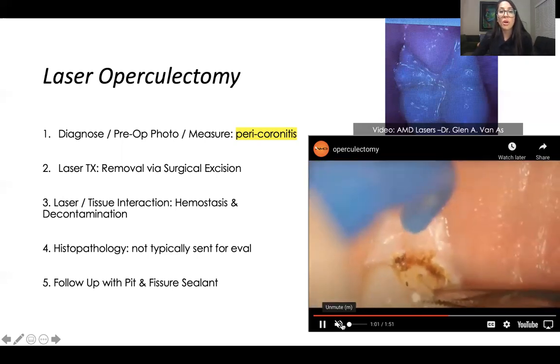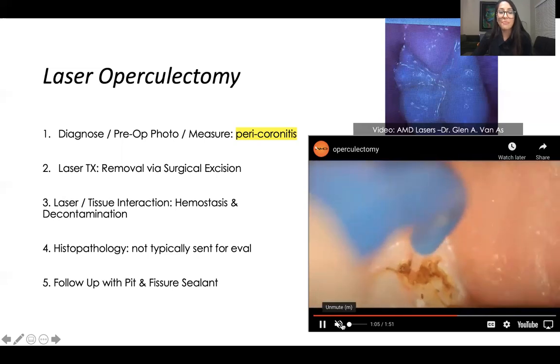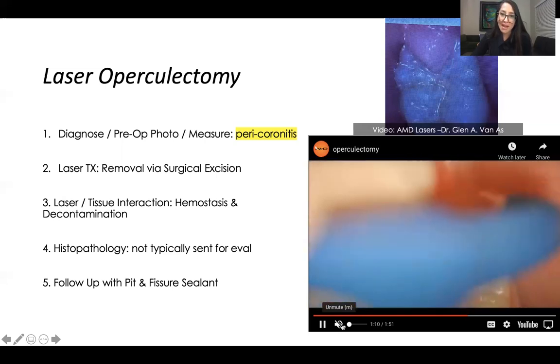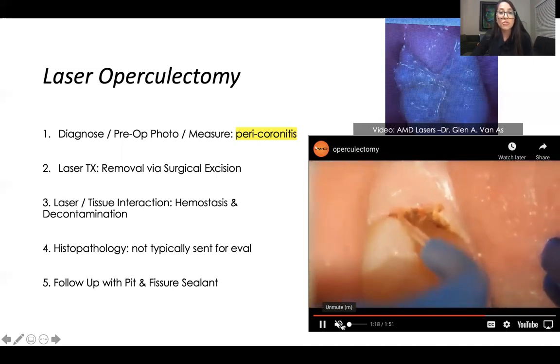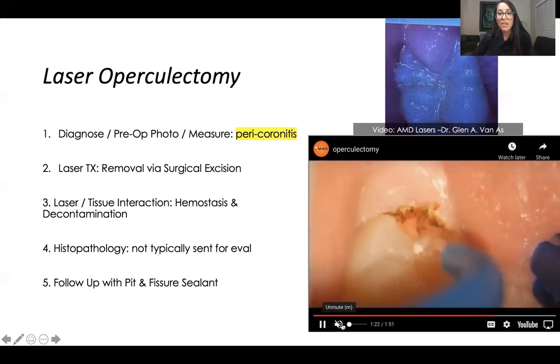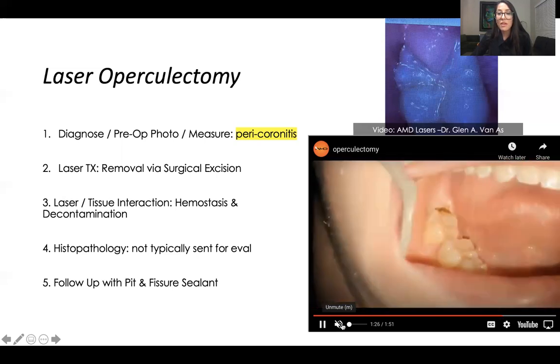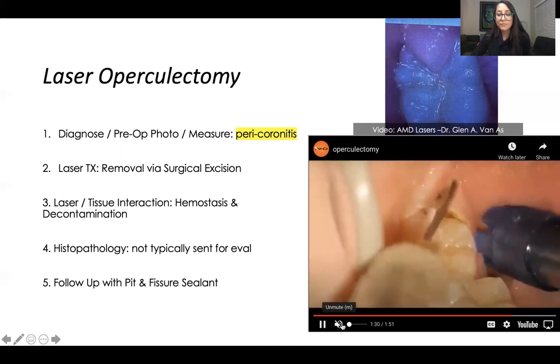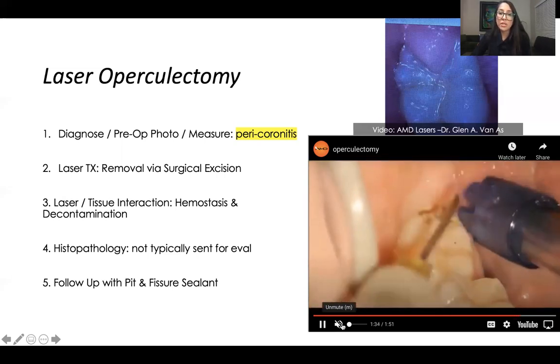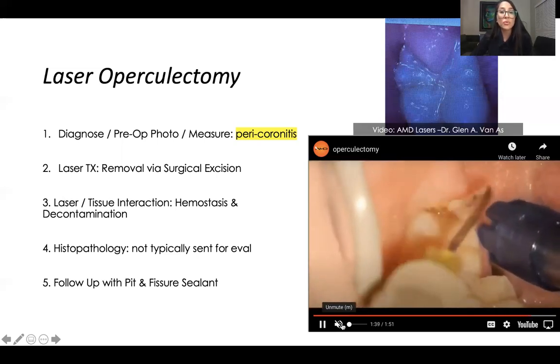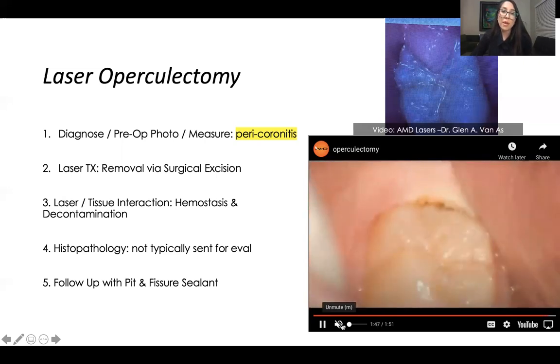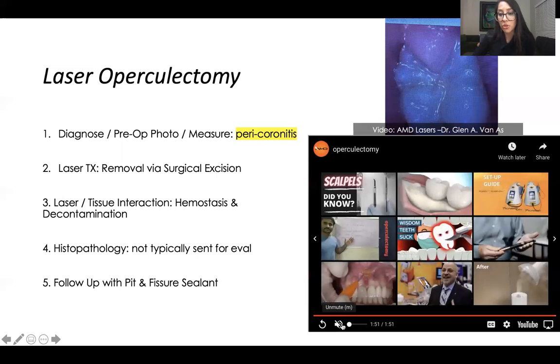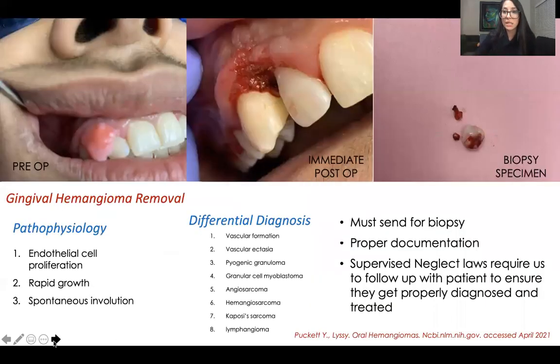For doctors accustomed to electrocautery, this does go much slower than electrocautery. But the benefit is it's less traumatic — it has laser energy that biostimulates the tissue and it's less invasive than cautery. The procedure took about a minute and a half. They paint a solution — basically just hydrogen peroxide — though I prefer vitamin E oil or coconut oil, because peroxide could potentially inhibit some of the healing mechanisms of the tissue. The result was a nice, beautiful, hemostized tissue, and we would very easily be able to lay down a preventative sealant thereafter.